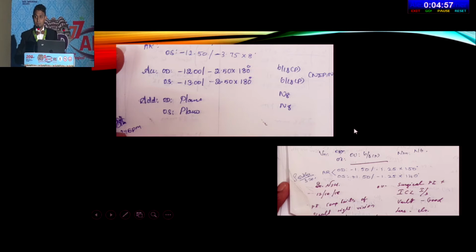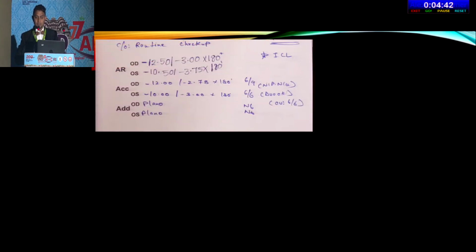I would say that is also one of the tips I learned in one of the conferences: do not check the vision individually after a week's time, because we have stereopsis and the patient might be high in one power and low in the other power, and they do increase reading a few lines as well. So this was with the cylinder where I used the toric.